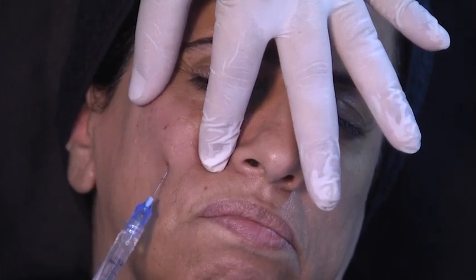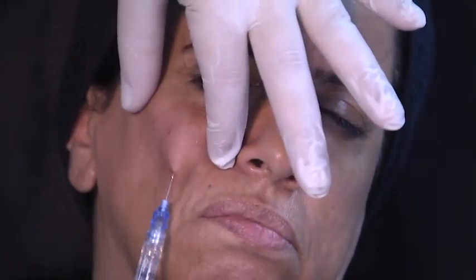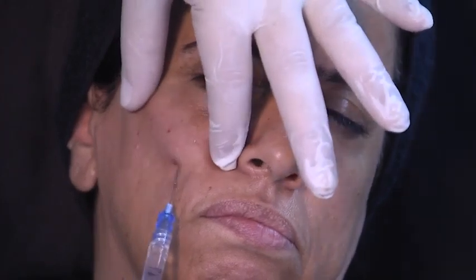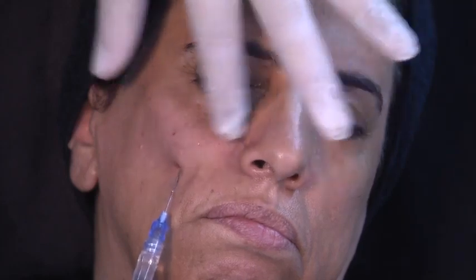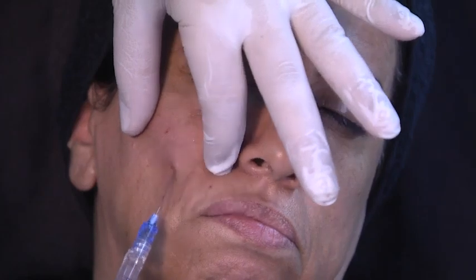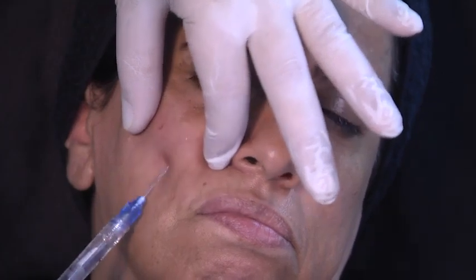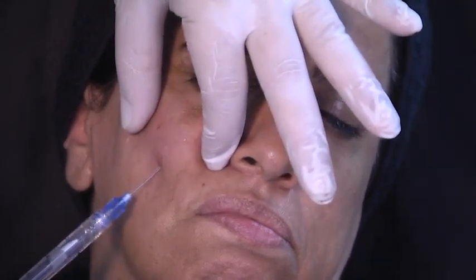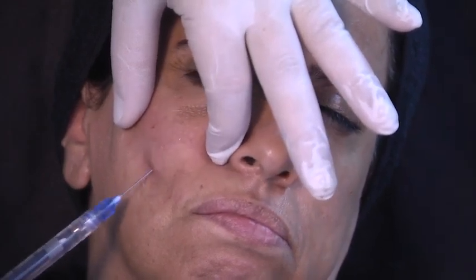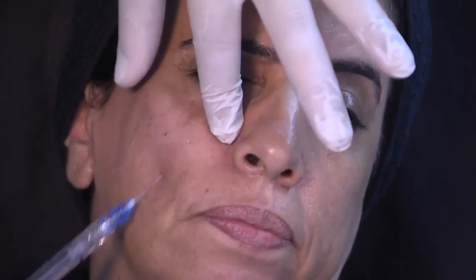I'm actually touching the bone. If I was touching a nerve or an artery, all the behavior of my patients has been extremely good. The first alert sign when we are in a vascular structure, I think, is pain. So it will be an alert sign if we have pain. Once I've done my bolus technique of 0.4, now I start doing my fan technique. I'm still deep. If I do it like this, I don't see my cannula. And I will finish my milliliter doing all the contour, creating a continuous convexity with the lateral part.